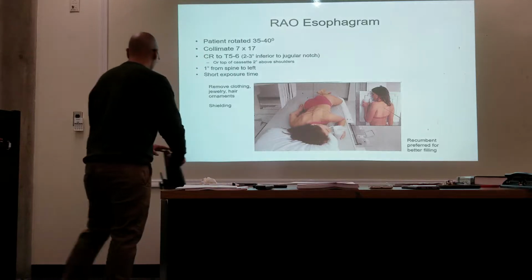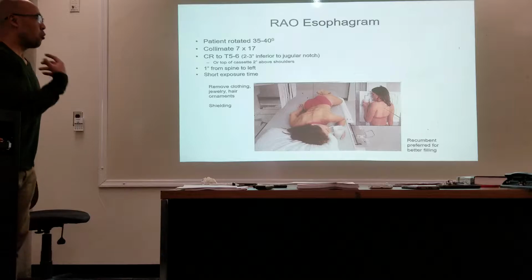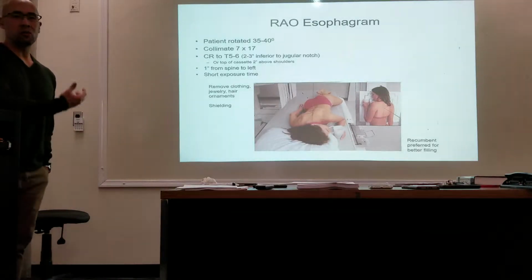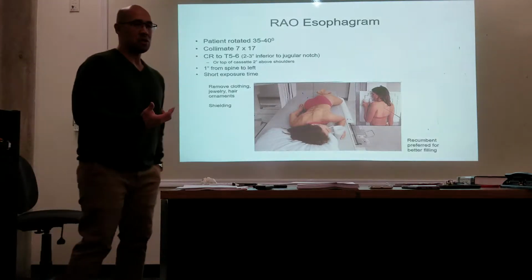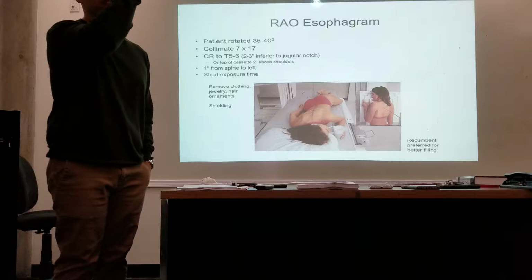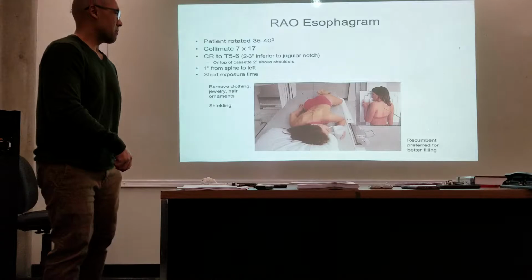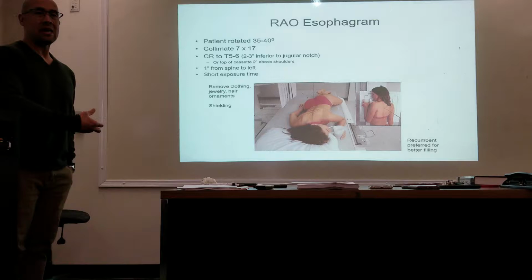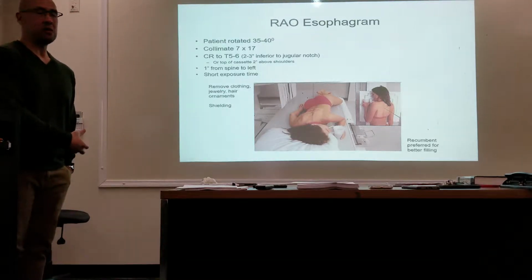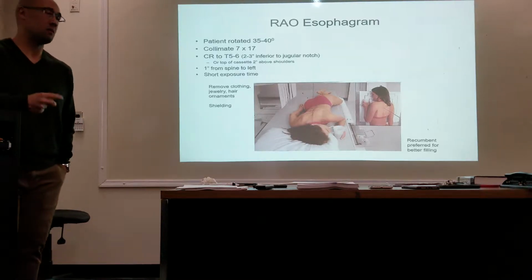Although the doctor does the study in an upright position, we as technologists usually do it in a recumbent position. They're laying down. In an upright position, the doctor during fluoroscopy can easily follow and track the contrast as they are swallowing it. We can't track that while they're standing up. Okay? It moves through their esophagus a lot faster. So when they're laying down, it is a better fill. The contrast doesn't empty as quickly when they are laying down. So we do it recumbent.